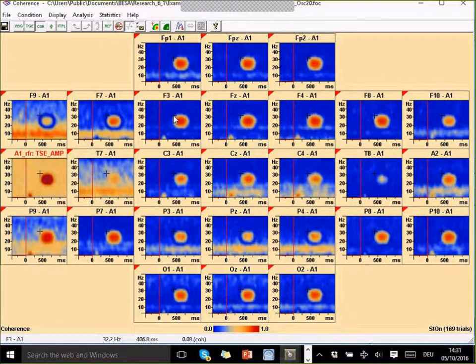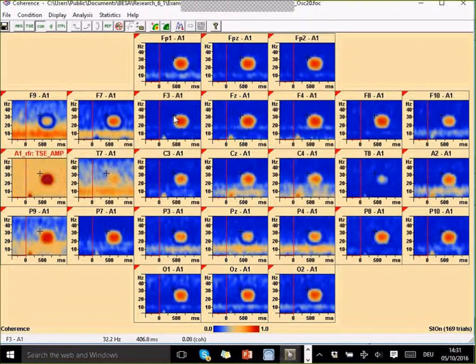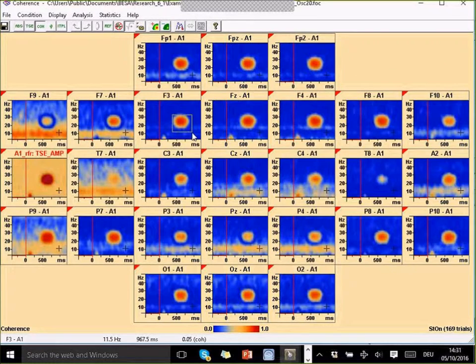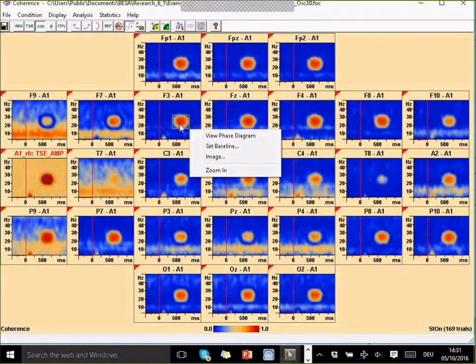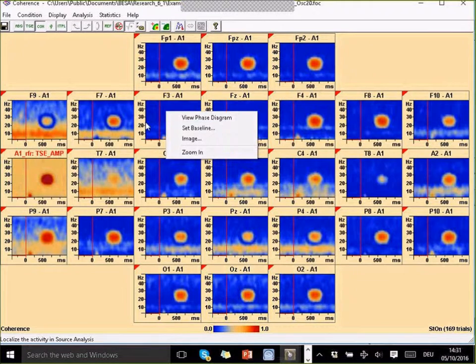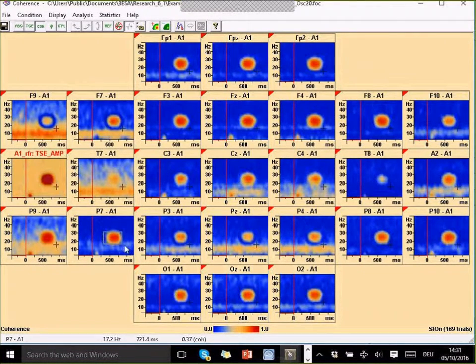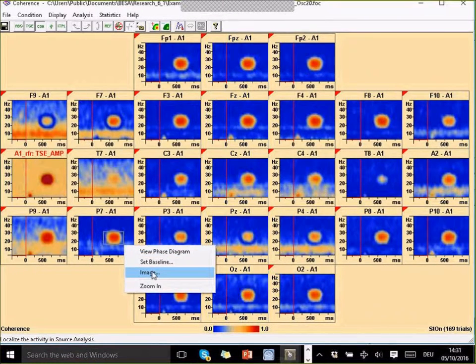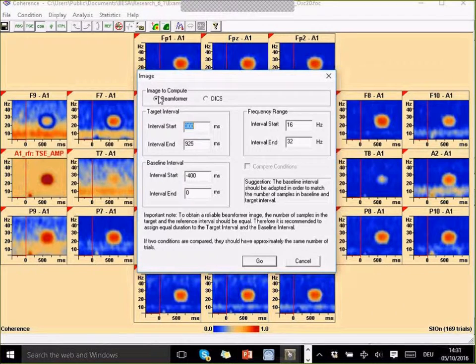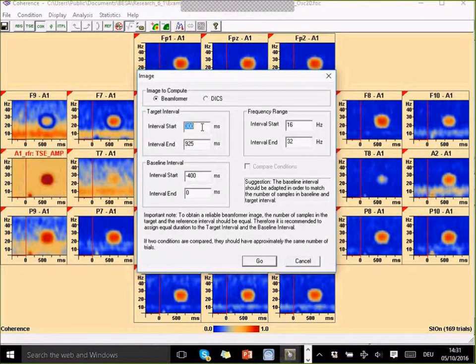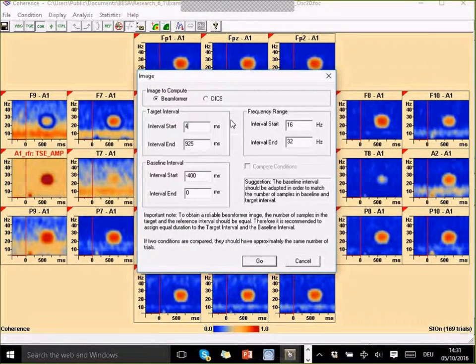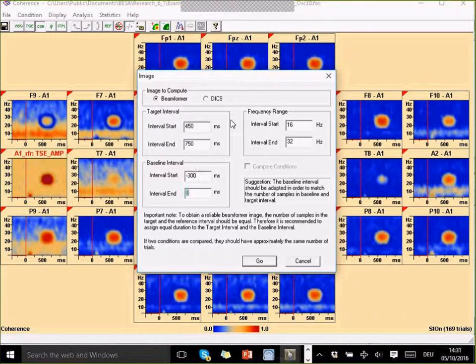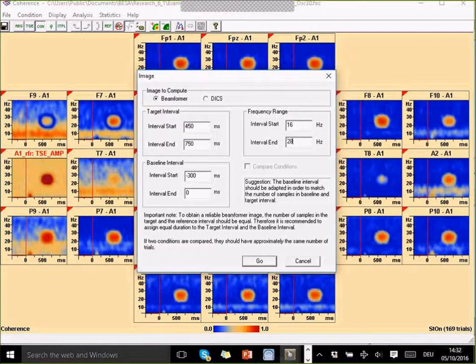One is that we can use the beam former on this time-frequency data to localize activity. If I find something that I'm interested in, I can left drag around it. I'm going to show you again. I'll go left drag and then I can select this image menu here. Now I can decide that I want to compute a beam former image. I'm going to work with an interval from say 450 to 750 and minus 300 to zero baseline and a frequency from say 16 to 28 Hertz and go.